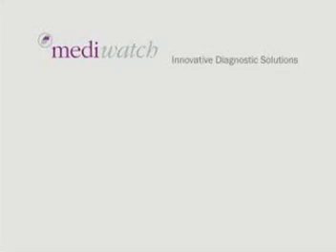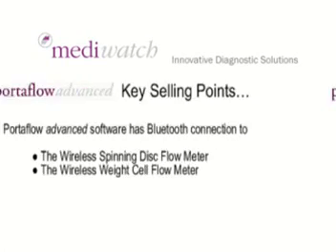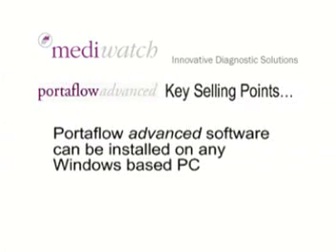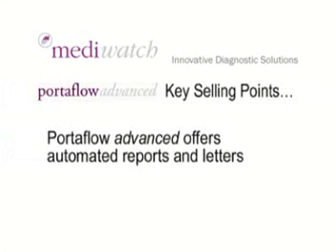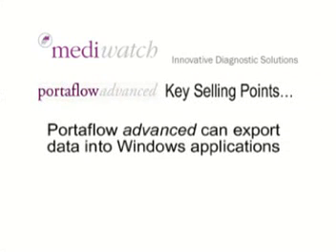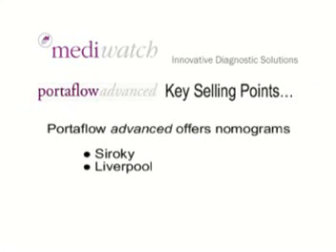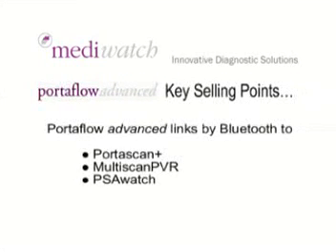A reminder of Portaflow Advanced key selling points: Portaflow Advanced software has Bluetooth connection to the wireless spinning disc flow meter or a wireless weight cell flow meter. It can be installed on any Windows-based PC. Portaflow Advanced offers automated reports and letters, and can export data into Windows applications. It offers nomograms — both Siroky and Liverpool — and links by Bluetooth to Portascan Plus, Multiscan PVR, and PSA Watch.